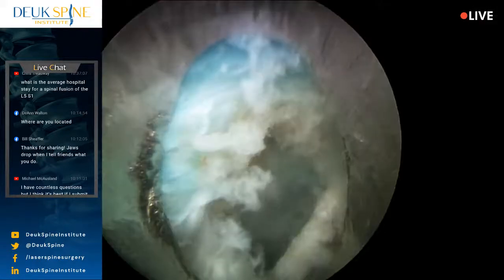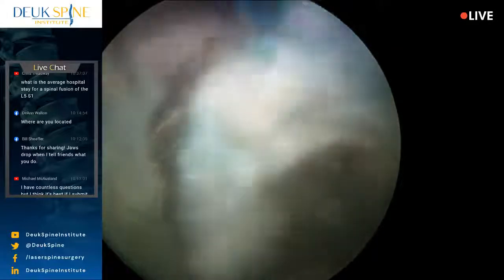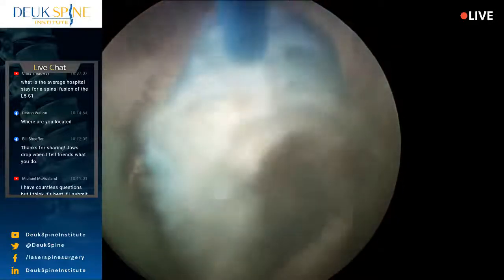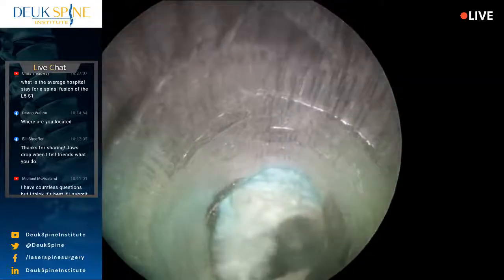One of the nice things about this laser that we use, called the holmium YAG laser, is that it doesn't just... Why don't you let him touch the buttons? Oh, he is?